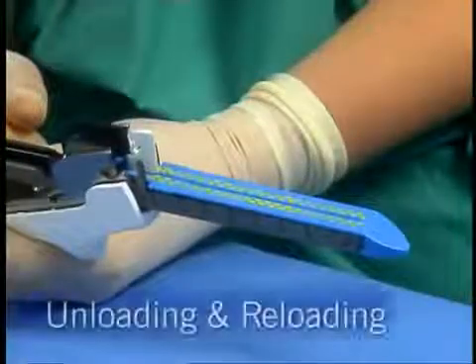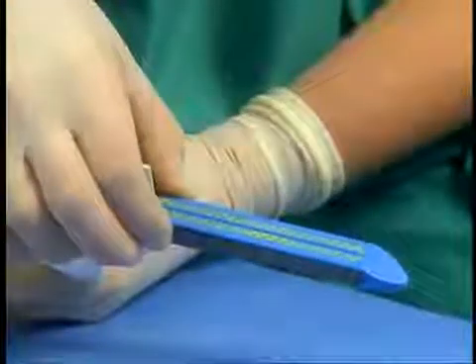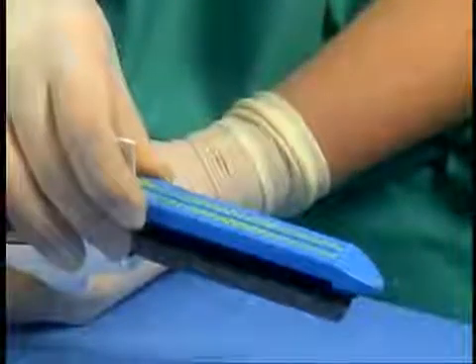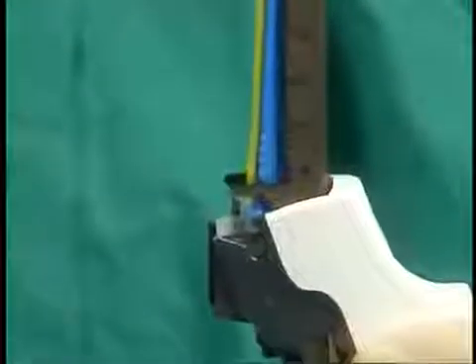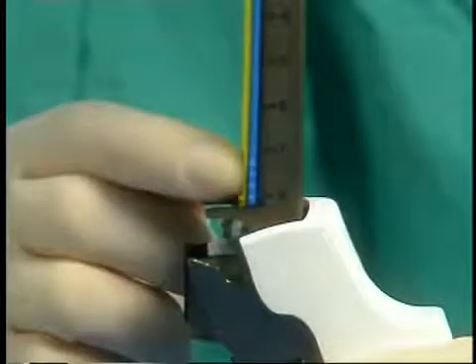The DST series GIA staplers and SULUs are equipped with a safety lockout that prevents the instrument from closing when a used SULU is loaded. To unload the SULU, grasp the cartridge half of the stapler with one hand and the bottom of the SULU with your thumb and forefinger, then pull the SULU out of the instrument. To reload, insert the SULU by seating its tip into the top of the cartridge fork as shown. Secure the SULU into place by pressing it into the cartridge fork — you will hear a click.